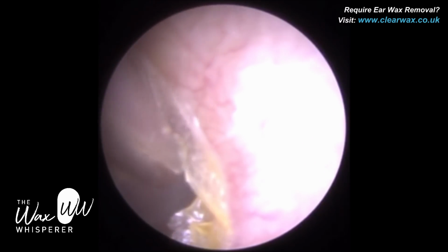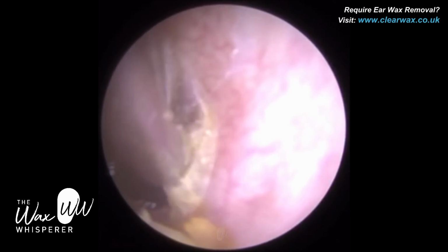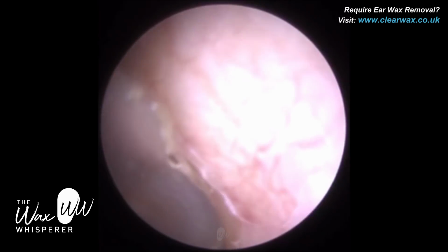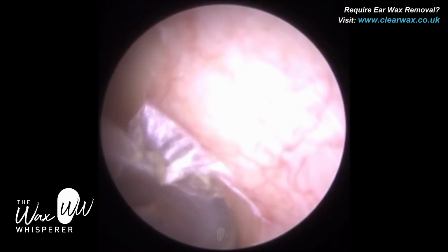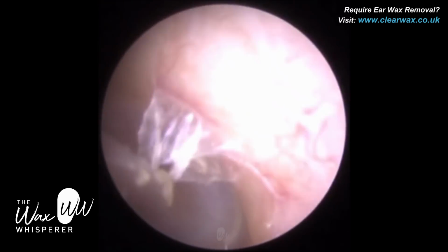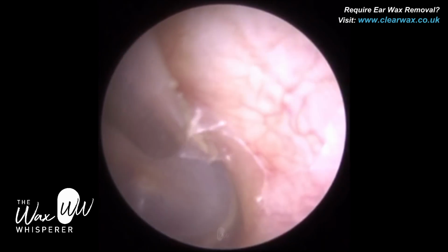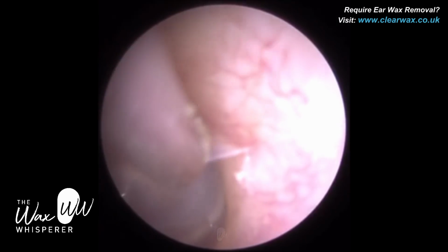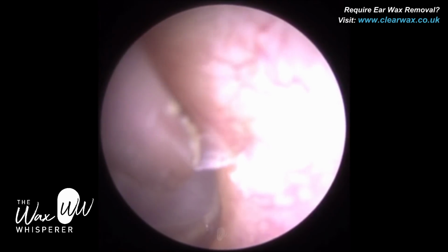So the left side is a lot more tedious. The skin, I wanted to remove it because, as I said, it's just going to come back for the patient. Even if I can give them an extra month of relief, it's important. So on the back part of the ear canal, I'm using a fine end gauge attached to a standard suction probe. And this is not really possible with some of the other visualization techniques.